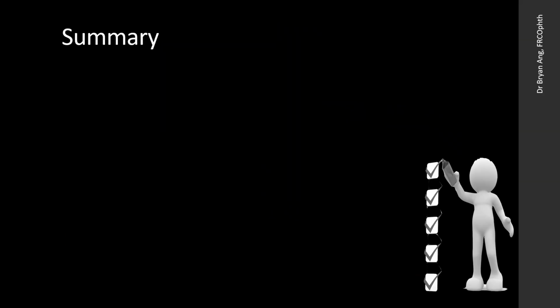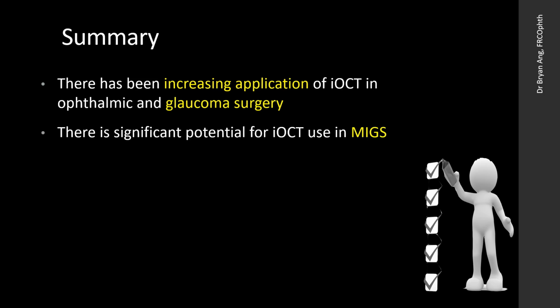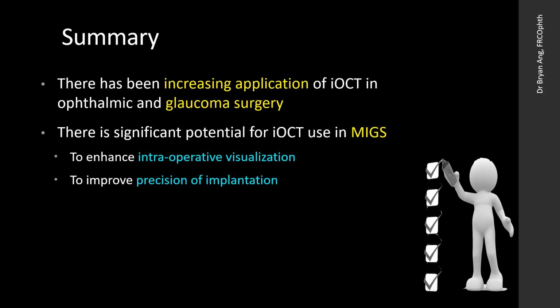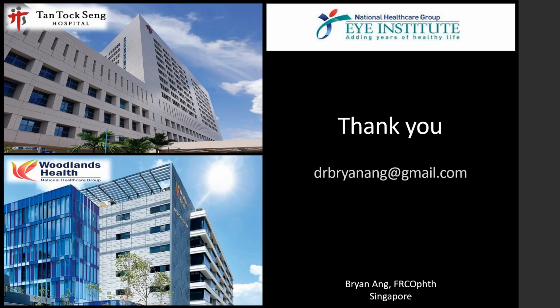In summary, there has been increasing application of the iOCT in ophthalmic surgery and in glaucoma surgery. I hope that I have further demonstrated the significant potential for greater use of the iOCT in MIGS, both to enhance intraoperative visualization as well as to improve the precision of device implantation. We look forward now to studies which can elucidate the impact of the iOCT on the surgical outcomes of these surgeries. I hope this has been helpful to you, and thank you for your kind attention.